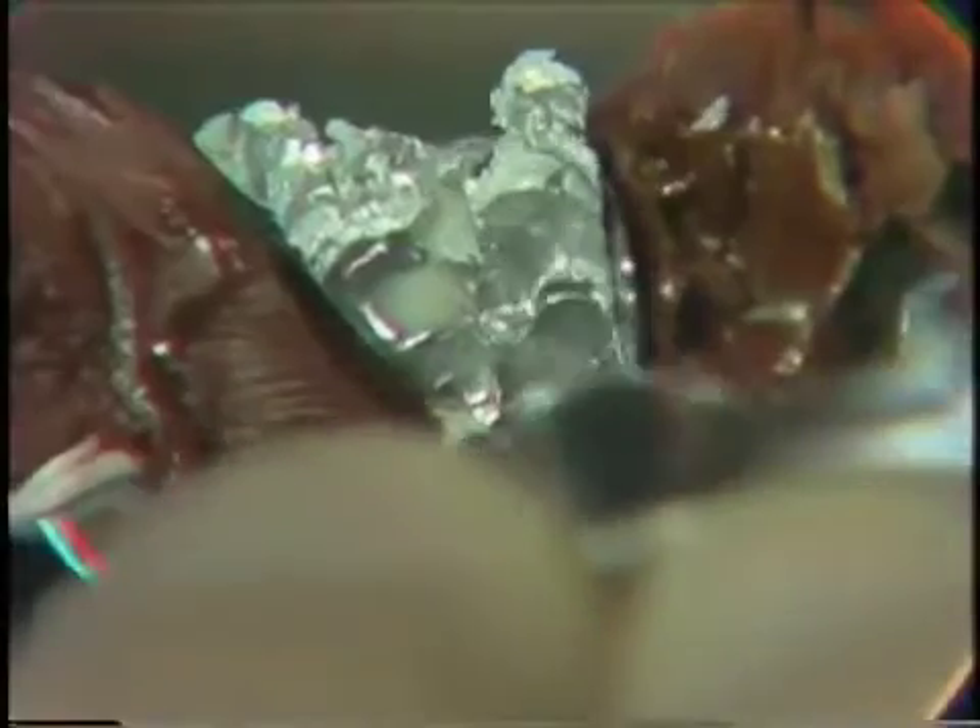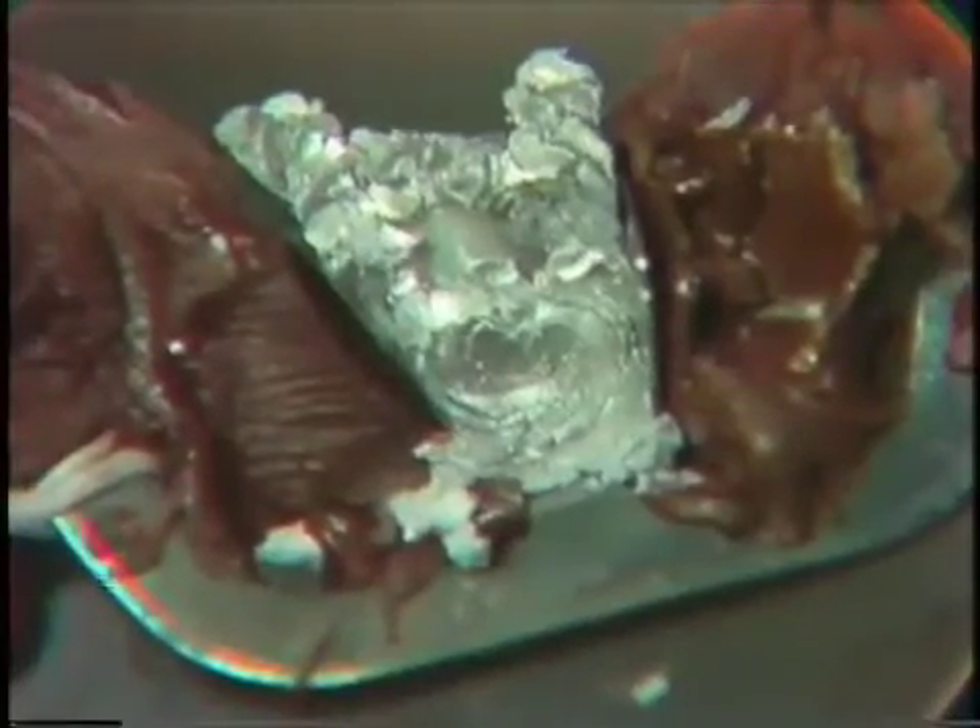We will use what is known as a paddle-shaped condenser next. You'll notice that we can get a lot of pressure against this amalgam and note the shininess. Now we've got our overfill and we're going to contour with the paddle shape.